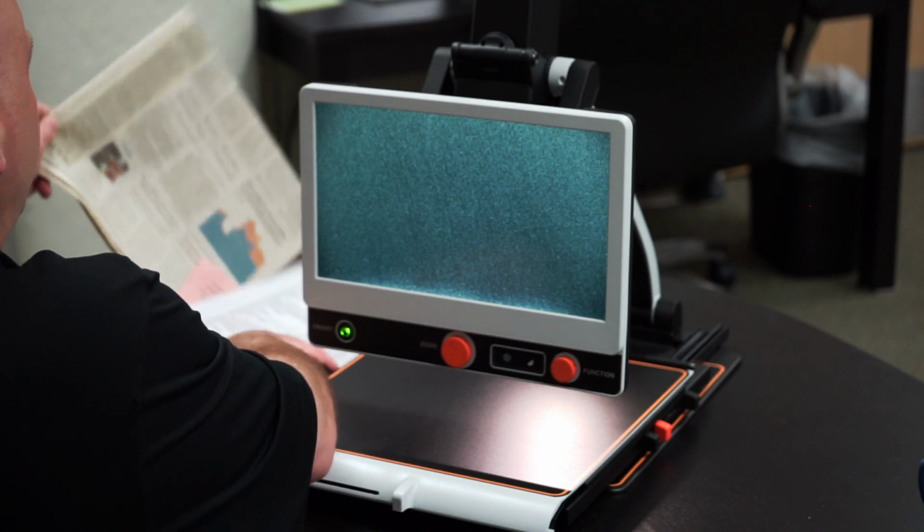So now, instead of me moving the document, which most people prefer to do, I'm not going to touch the document at all. I'm going to move the table. For those of you who have never used an XY table, take your hands and put them flat on the table, so you want to stabilize your hands. Once you stabilize your hands, all you need is your thumb and your index finger on each side of the XY table. One's the accelerator, one's the brake, controlling how much tension is on it. So my hands are relaxed, they're on the table, it's on a stable desk or table, and I'm just moving this around. So that's how you use an XY table to assist you with reading.